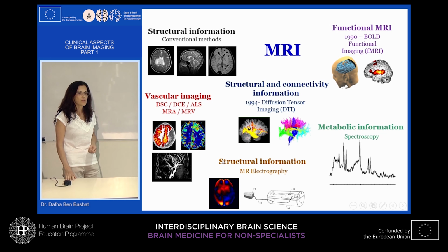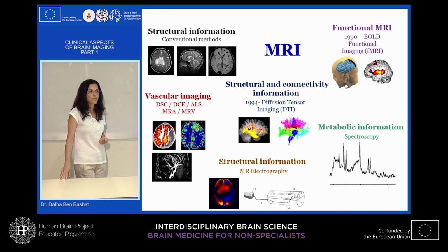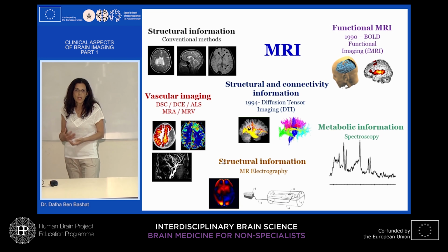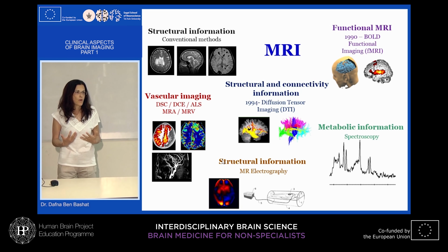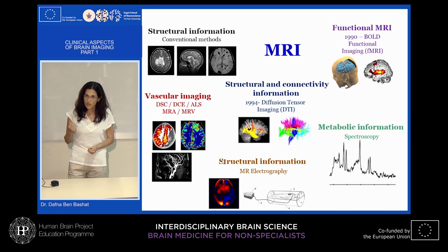In MRI, there can be more than 20 methods, and all the time new ones evolve, each detecting properties of the tissue. And from each method, we can also extract a few parameters. The main idea is to get those parameters, which indirectly represent the microstructural properties of the tissue. There can be about 40 or even more parameters that describe the tissue.